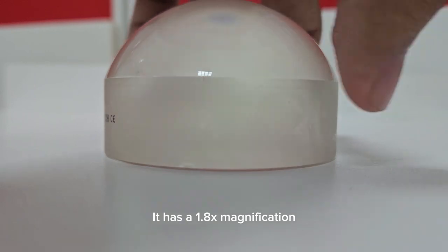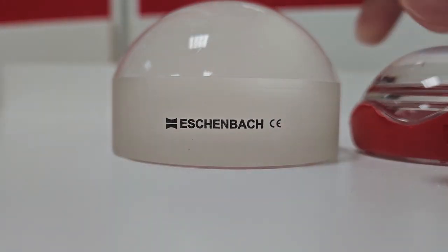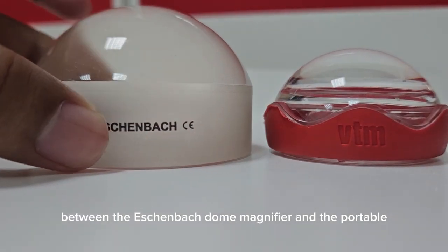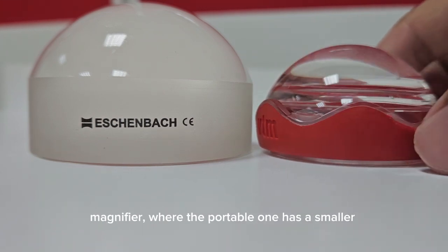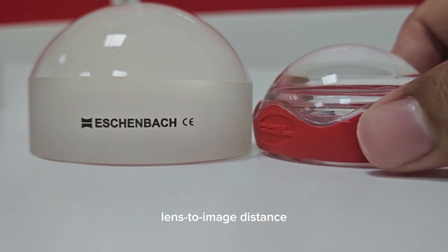It has a 1.8 magnification with a lens-to-image distance of 1.96 inches. From here, we can see the difference in size between the Eschenbach dome magnifier and the portable magnifier, where the portable one has a smaller lens-to-image distance.